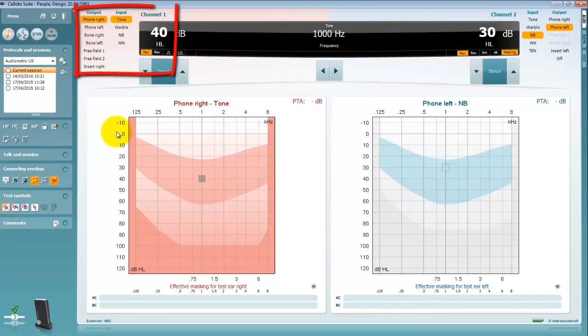Channel 1 is always the test ear. Despite this being positioned above the right audiogram you'll notice it can be configured to test for both the right and left ear.